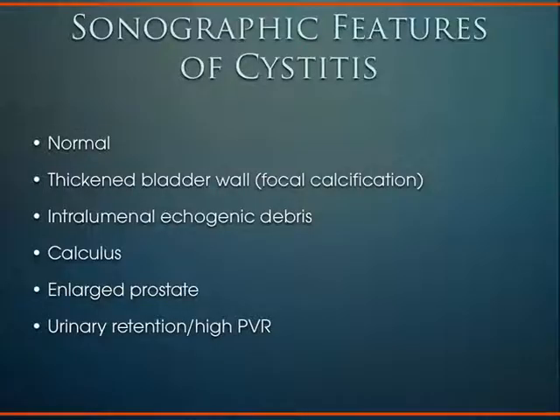You can also make a diagnosis of a bladder infection or confirm the diagnosis. Again, usually a very clinical diagnosis, but sometimes the patient can't talk to you, or they're too young, or they're intubated, and you're wondering why they have a fever. As you're doing your fever survey with ultrasound, you can come down to the bladder and you'll see a thickened bladder wall.